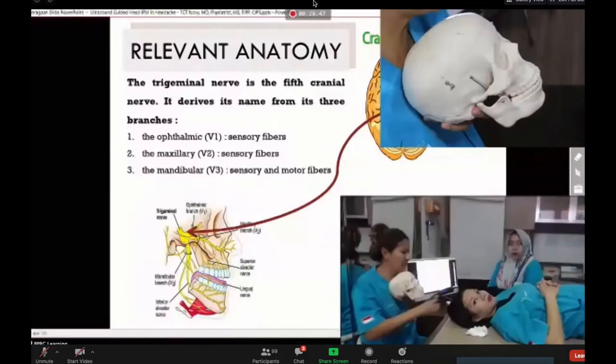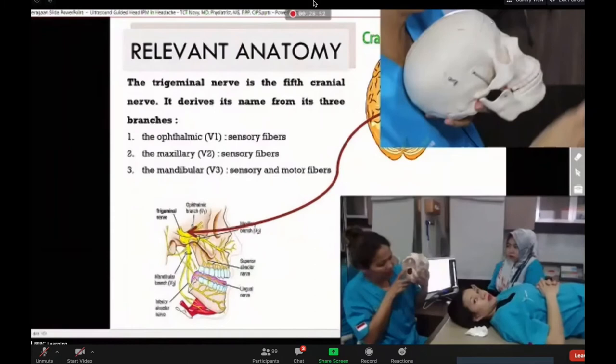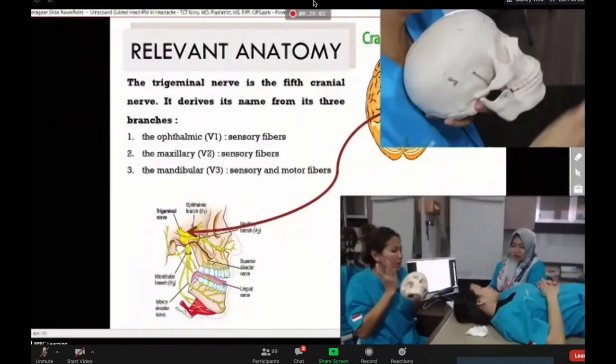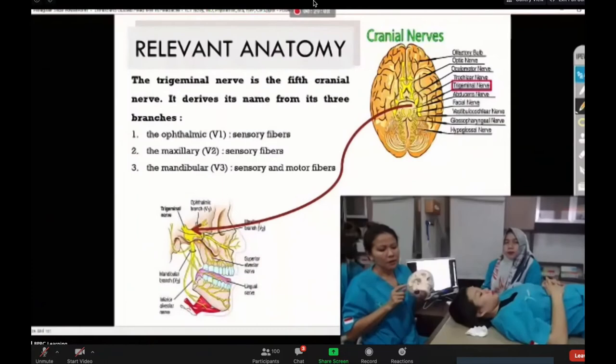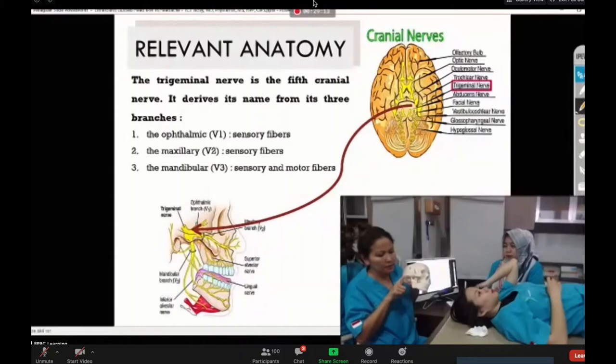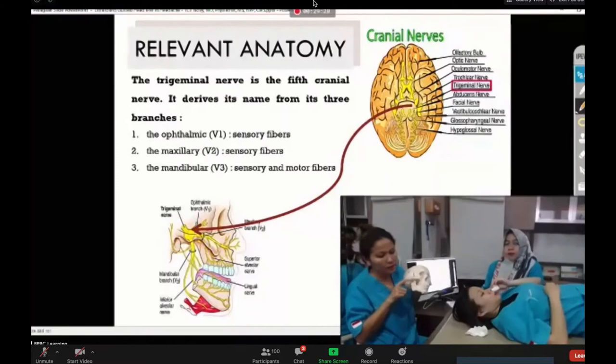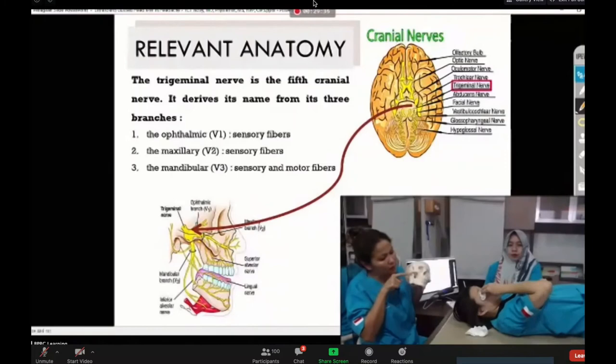Then the trigeminal ganglion is inside here, through the foramen ovale here, inside the basis cranii there. But how we reach there using ultrasound cannot. From here, cannot be reached. So what we can do is do infiltration block actually. From here, this is the temporomandibular joint. Okay, this is the condyle, and this is the coronoid process, and this is the mandible. The mandible is below here, and this is the maxilla, right? This is the hole here. This is called coronoid notch here. We can insert our needle right there.